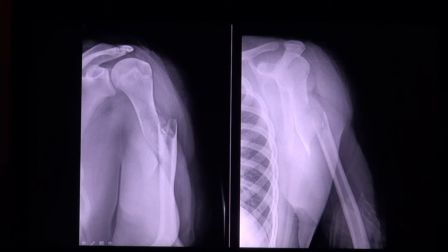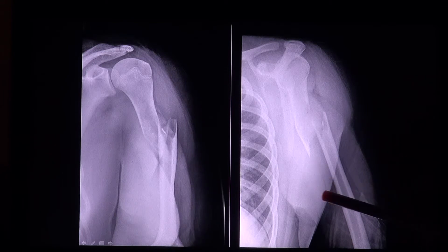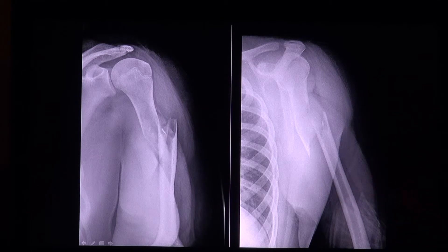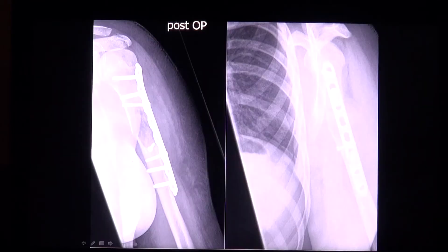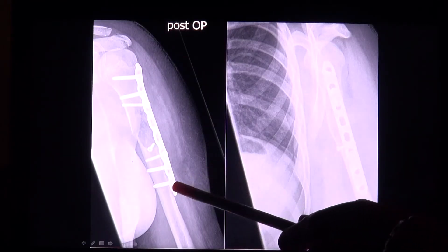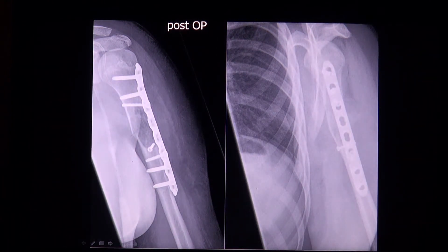Usually there is no need to do a CT or MRI scan in order to confirm the diagnosis, and it has not been done in this case either. The fracture was treated surgically, as seen here, and the diagnosis was confirmed intraoperatively.